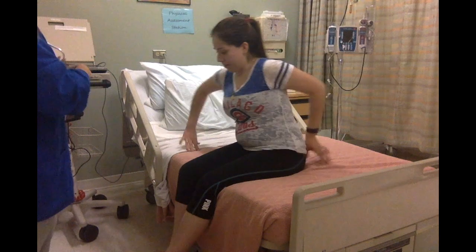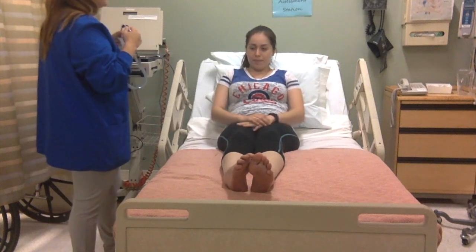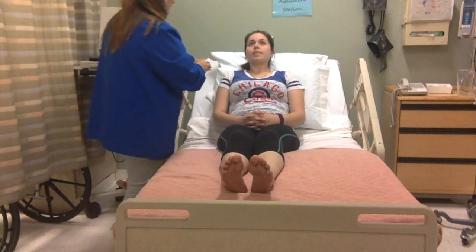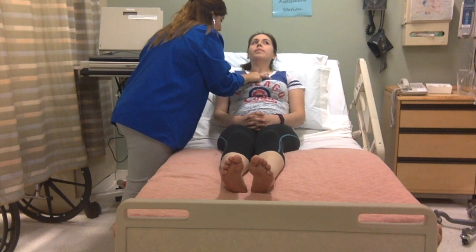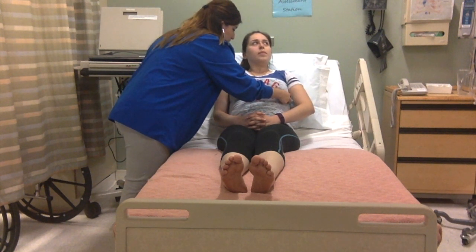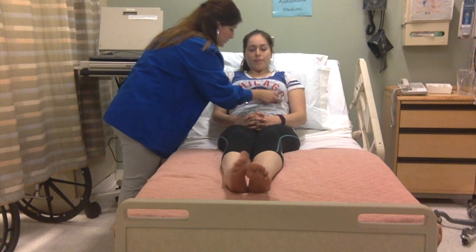Okay, so if you could go ahead and lay down for me. Here's lung sounds, and then I'm going to stop at the apex of your heart and listen for a minute, okay? So just take a deep breath every time I move my stethoscope. Okay, I'm going to listen to the apex of your heart, okay? So just breathe normally.